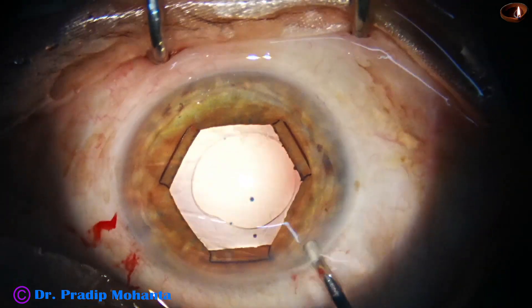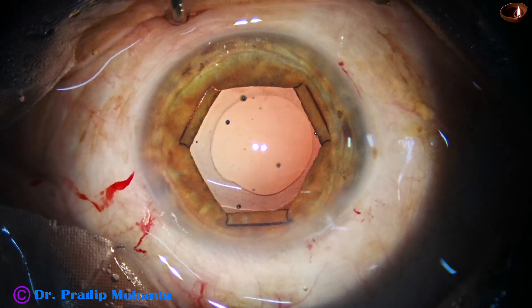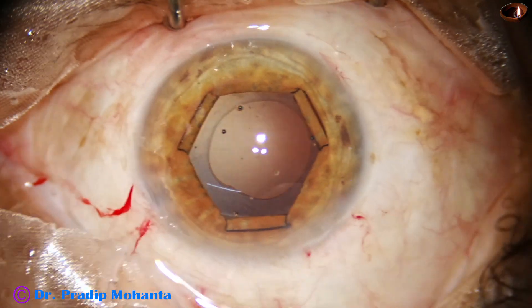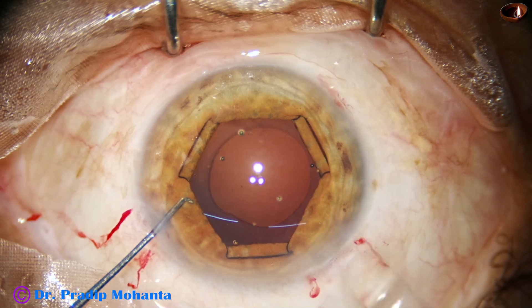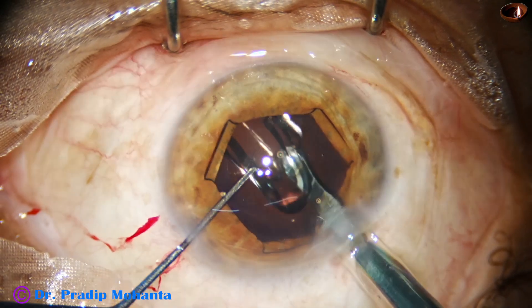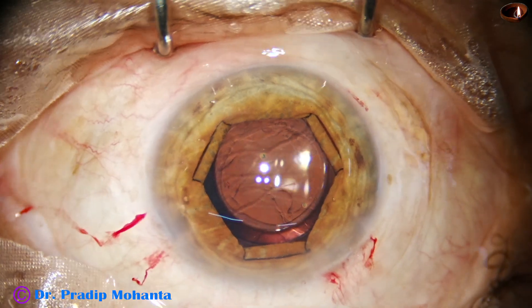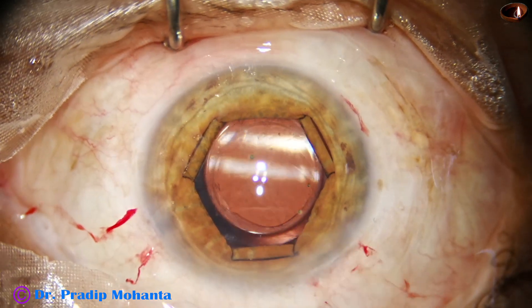When the B-hex has been used to dilate the pupil, I prefer to implant the lens using VISCO. Fill up the bag and the anterior chamber with VISCO, and then here goes the intraocular lens. The leading haptic goes in and then the trailing haptic also goes. The lens is in the capsular bag. Just rotate the lens to position it so that we can go behind the lens and clean the VISCO from the capsular bag.